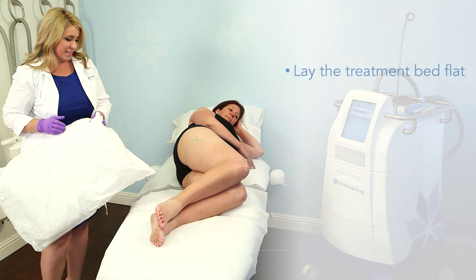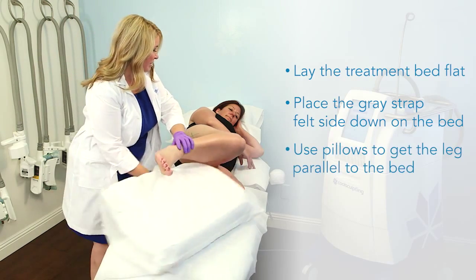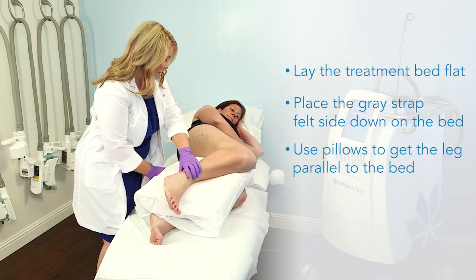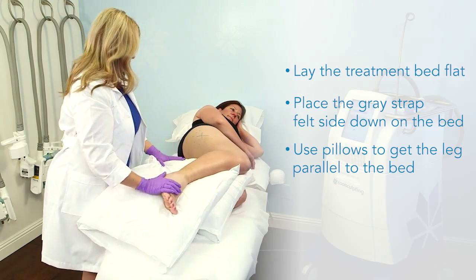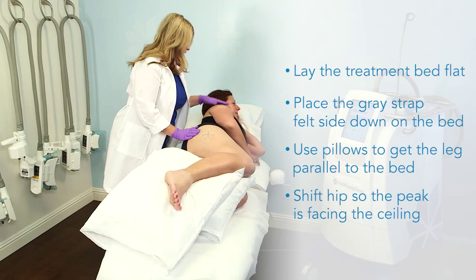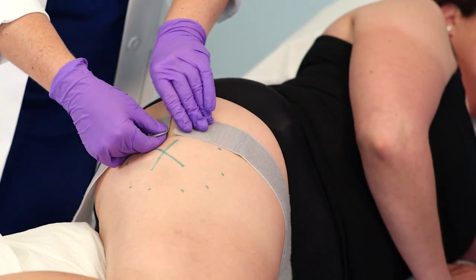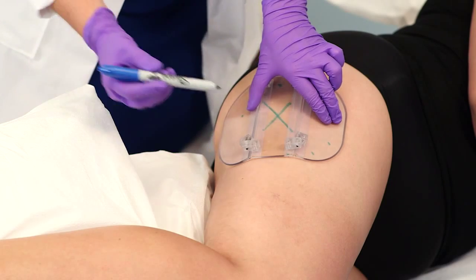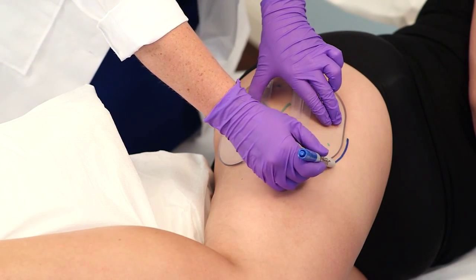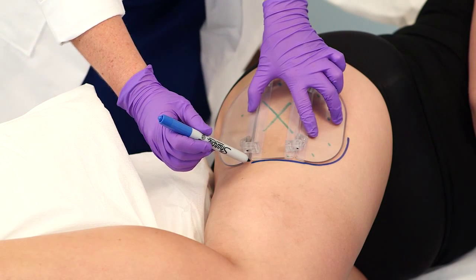The treatment bed should be completely flat with a protective cover. The gray strap should be on the bed felt side down, approximately at the location of the patient's hip. Use one or more pillows between the legs to help lift and flatten the leg so that it is parallel to the bed. Shift the patient's hip to ensure that the peak of the bulge is facing the ceiling. Check the gray strap to confirm the ends meet in the middle of the X marking. Center the CoolSmooth applicator planning template over the peak of the bulge and confirm that all three panels are in direct contact with the skin, then outline the template with a permanent marker.